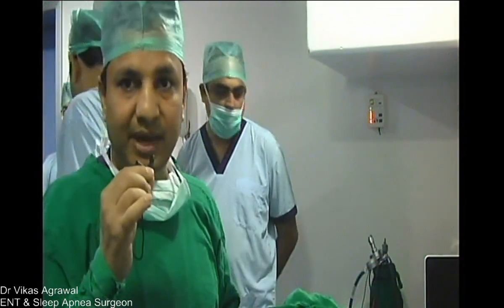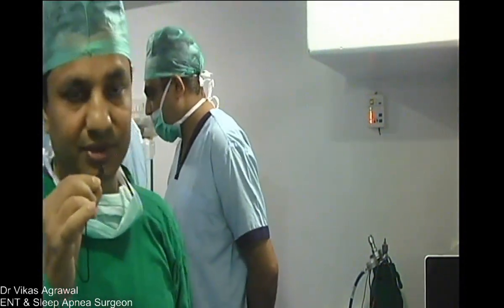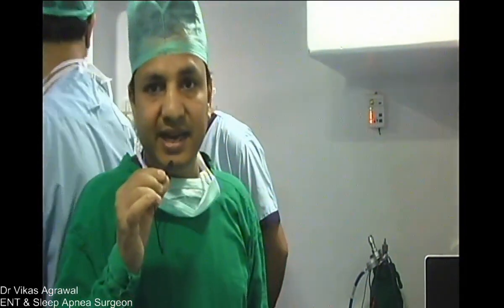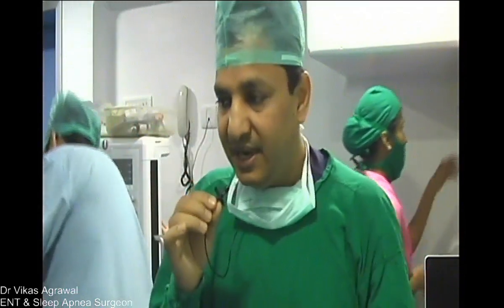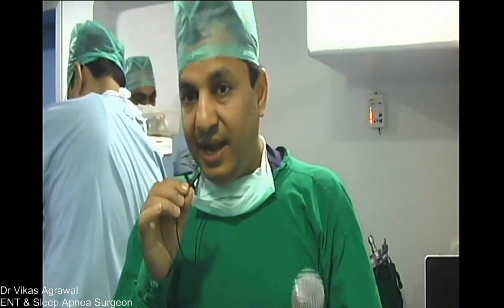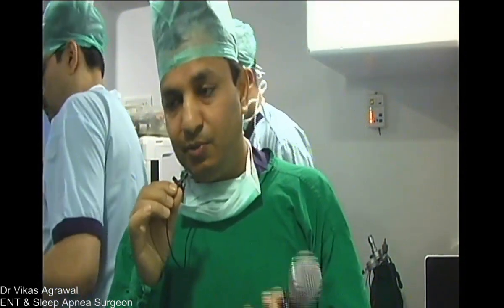What is important is that while putting in the nasal tube, during intubation or extubation, there should not be any bleeding from the nose. If there is bleeding from the turbinates, it will again create a lot of difficulty in extubating as well as intubating, because the airway is already compromised and vision is already difficult. So Dr. Kalpesh will take adequate precaution by preparing the nose first and going very, very slowly. If required, he will use a nasal dilator first, a nasopharyngeal tube, and then only put in the endotracheal tube.